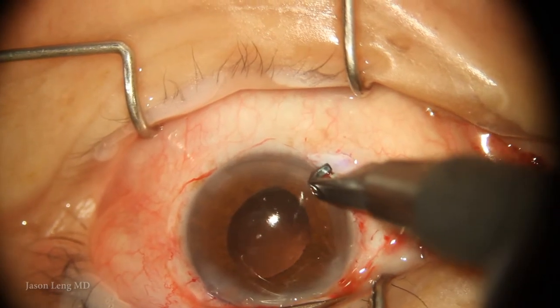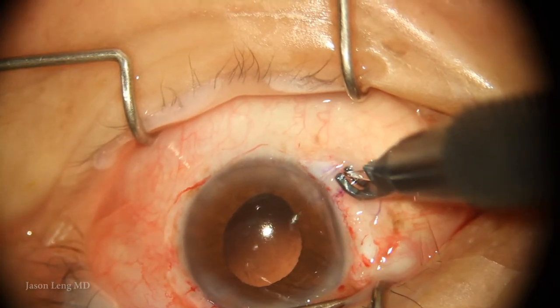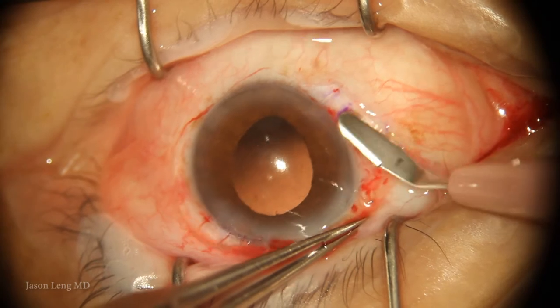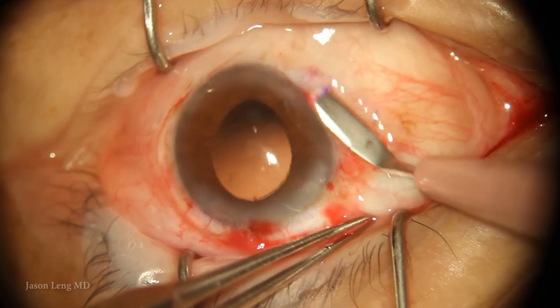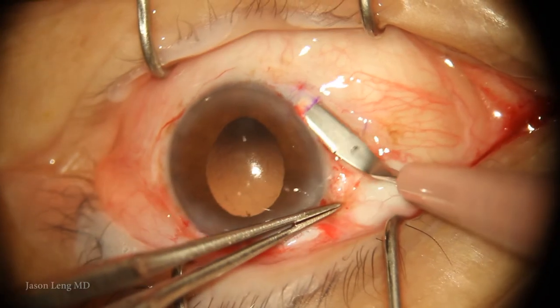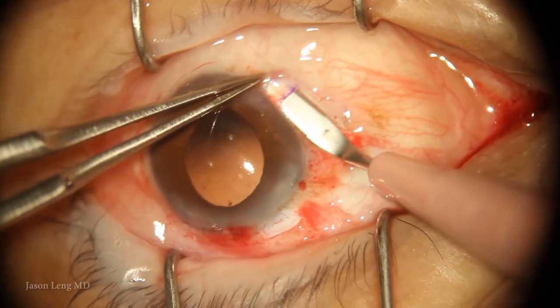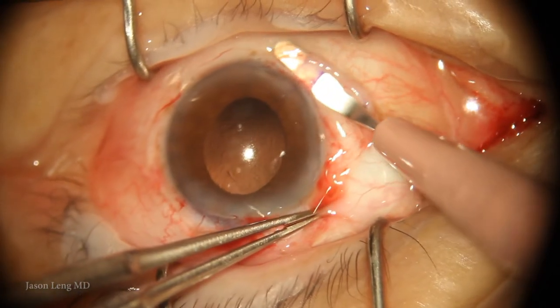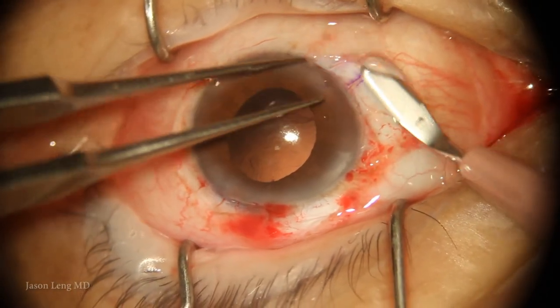I had already operated on his other eye and he had a very thin sclera — I actually perforated one of the flaps on the opposite eye. So I'm being pretty cautious and erring on the thinner side. Here I'm using a crescent blade to tunnel under the scored areas, proceeding very carefully. Once I reach the other end, I push down with the 0.12 forceps and use a side-slicing motion to get a decent but thin flap.